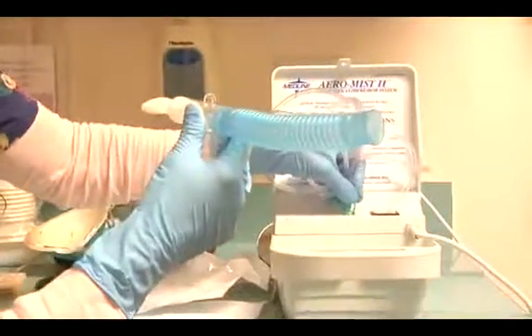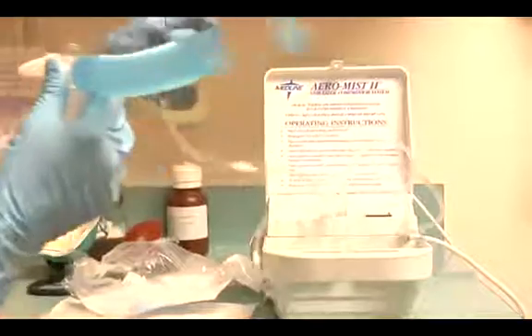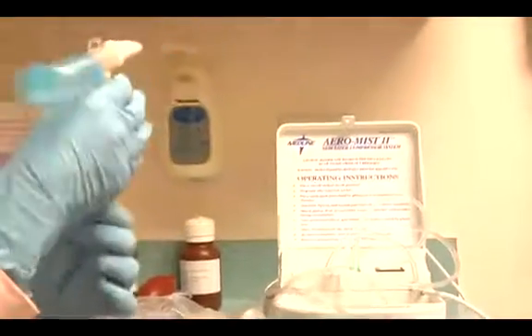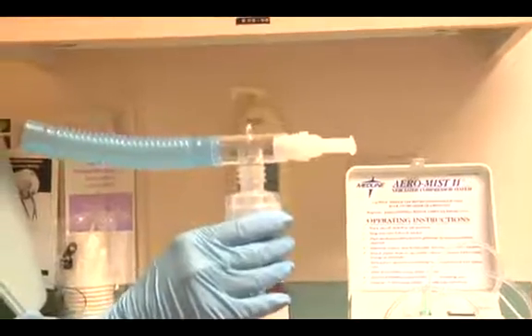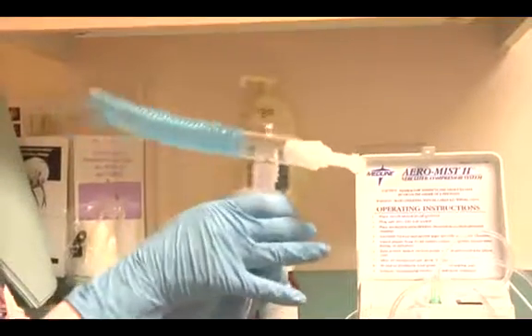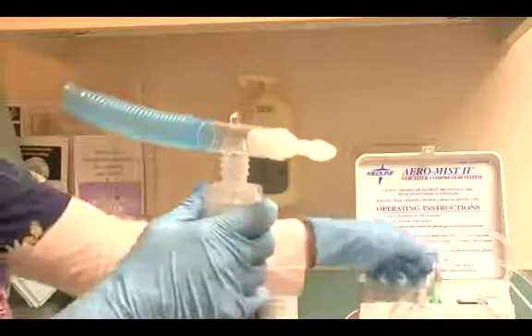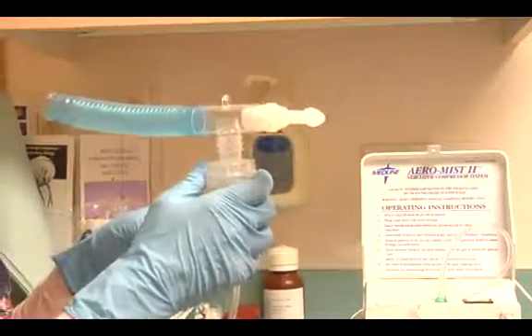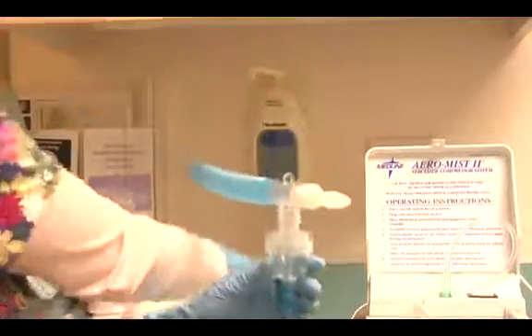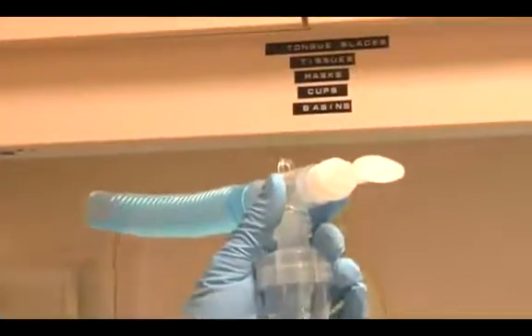We're now going to assemble the tubing, which has a connection on the nebulizer machine as well as the tubing. We're going to make sure everything is tight, and oftentimes we'll check that the mouthpiece is comfortably situated to go directly into the patient's mouth so that it's straight. And then all we do is go ahead and turn the nebulizer on.